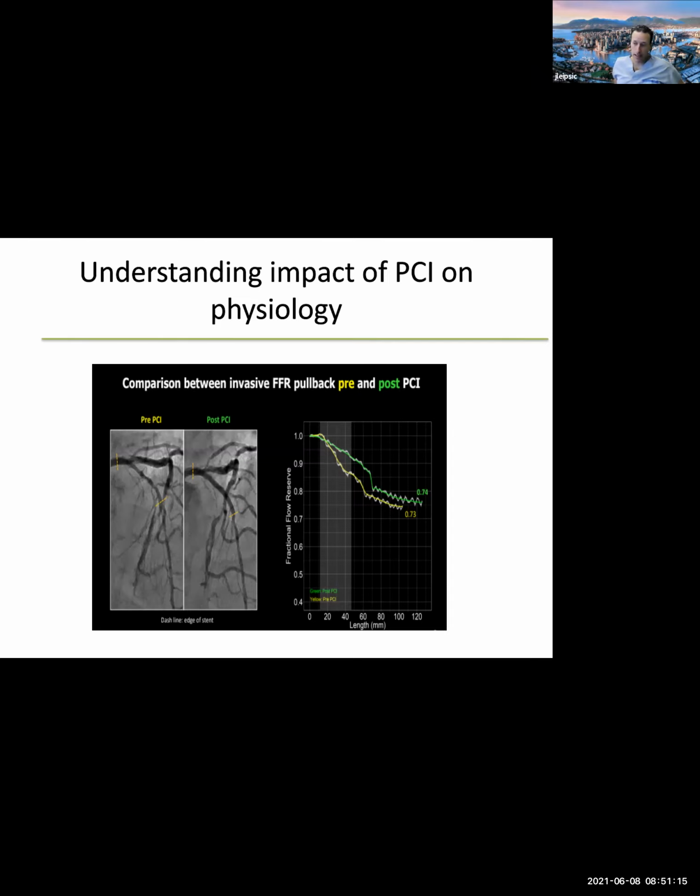I think we can do it, and I think we can do it well, especially if we do it thoughtfully and we understand why we're doing the test, right? I think that if CT serves solely as a gateway to the cath lab, if you're going to send every patient and their sister to the cath lab for every moderate lesion and you overestimate stenosis or you have inexperienced readers, then I would say not. But I know who your readers are, and I know the type of practice that you have, and I know the integration between cardiology and radiology, which allows for really good collaboration. I think that you can do CTA in that setting, understanding that there's going to be some limitations.